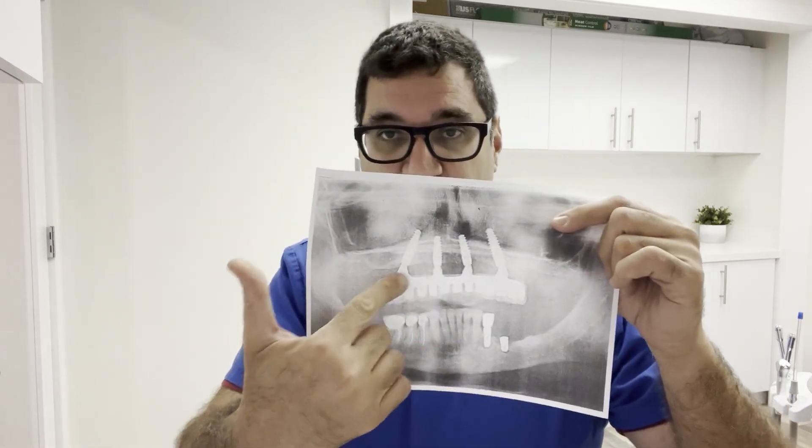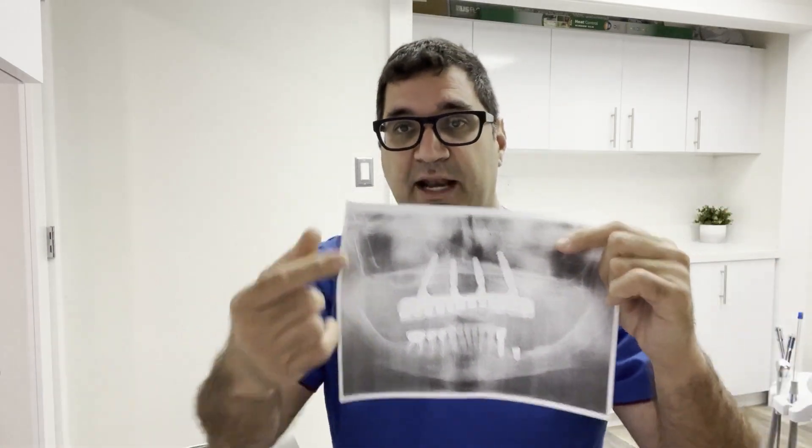The biggest problem with full mouth implants is the bone — you can't just go and put 10 implants in somebody's mouth without preparation. That's why all-on-four is so popular as an alternative: with all-on-four, you just need to put four implants in areas where the bone quality is fantastic — the front. With full mouth implants, you have to address the back area as well, which is where it gets difficult.